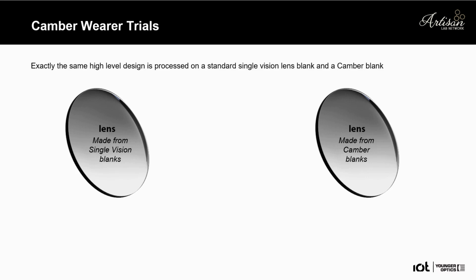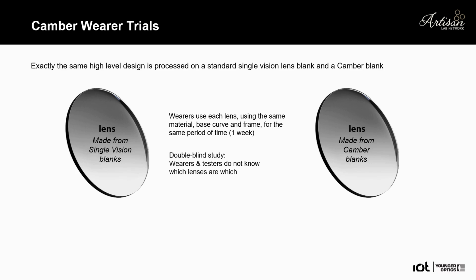Exactly the same high-level design is processed on the standard single-vision lens blank and the Camber blank. The wearers use each lens using the same material, same base curve, and the same frame for the same period of time, which was 1 week.